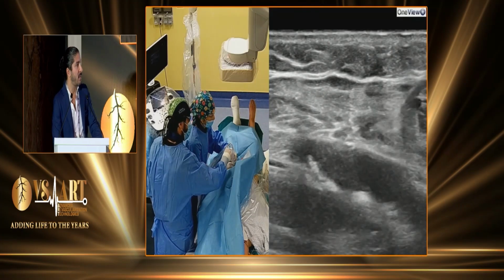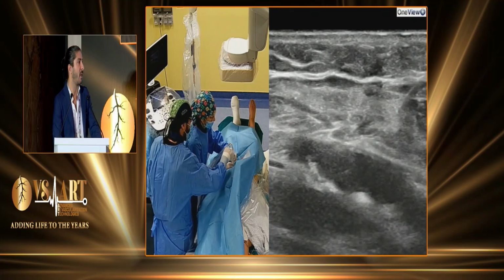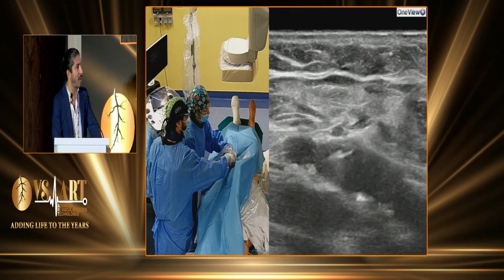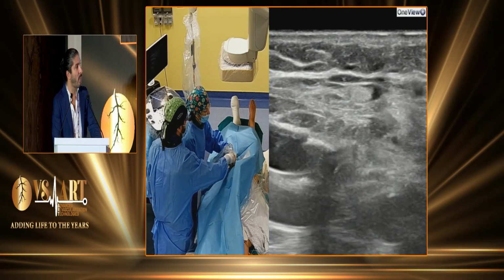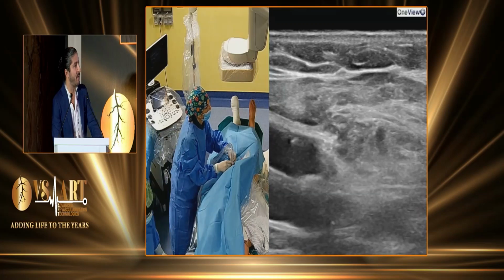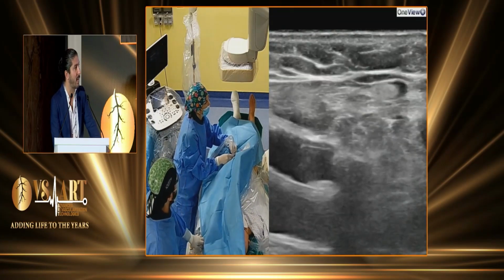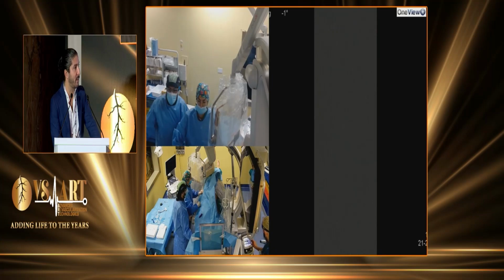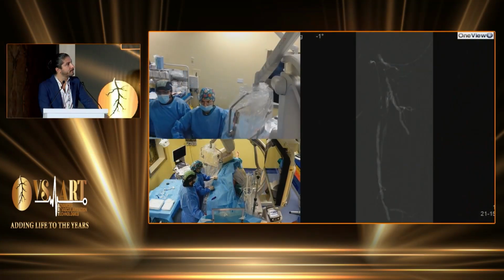This is the case. I did an antegrade access in the common femoral, and in the ultrasound you can see the needle and the guide wire, wiring super selectively the SFA. We deploy a 6-French sheath, and after this we start with the angiography. CO2 angio shows us a patent femoral artery.